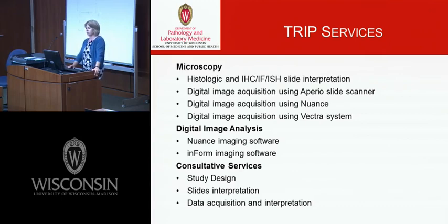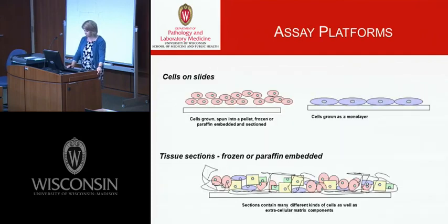Once images have been acquired, they can be analyzed using the two software systems here, either Nuance or inForm. And we have consultative services, so study design, slide interpretation, and then data acquisition and interpretation of those results are also available for investigators.